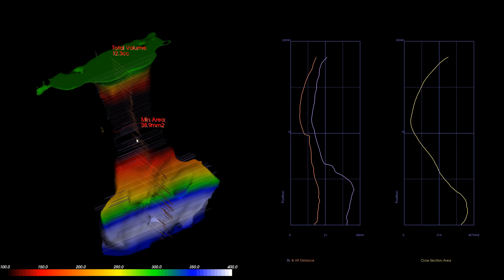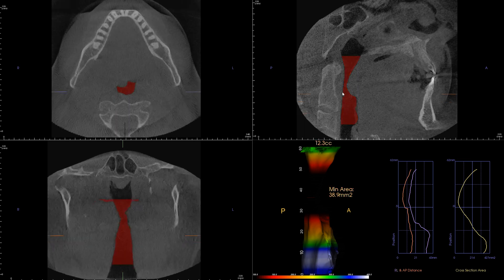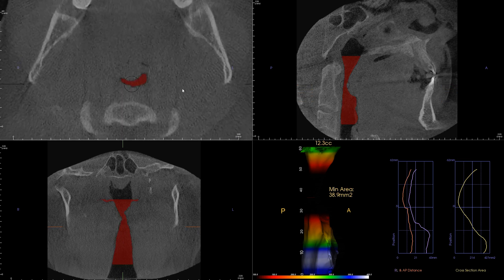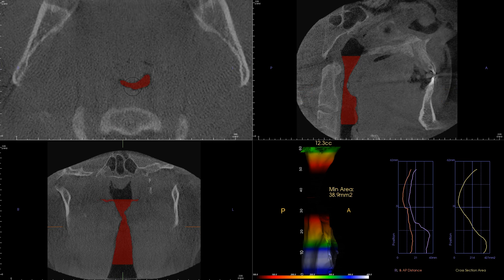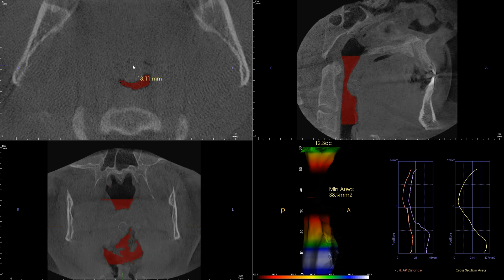Let's figure out the approximate dimensions of the airway. Let me get to the area of interest and zoom in for a rough estimate. In the transverse direction I'm measuring about 13 millimeters at this level, and in the AP direction I'm getting about 3 millimeters.